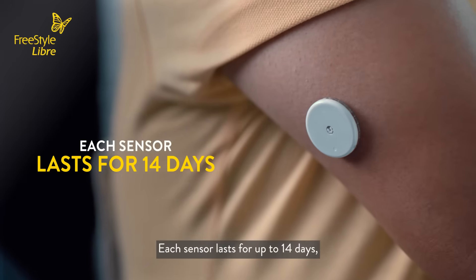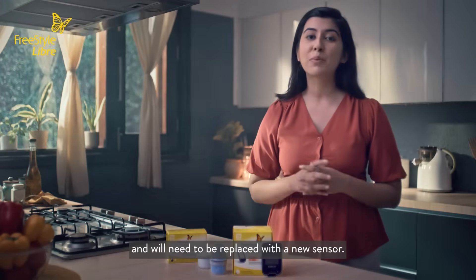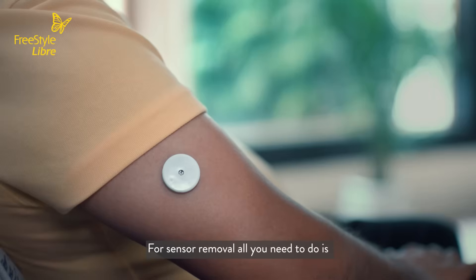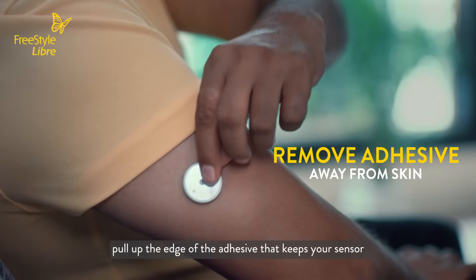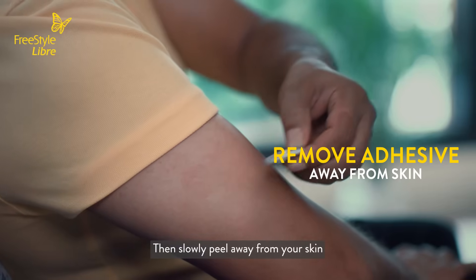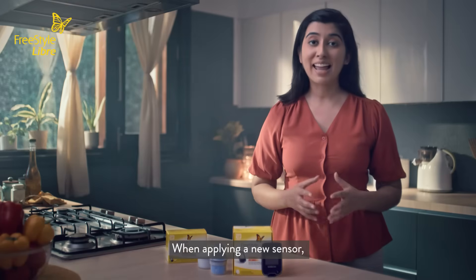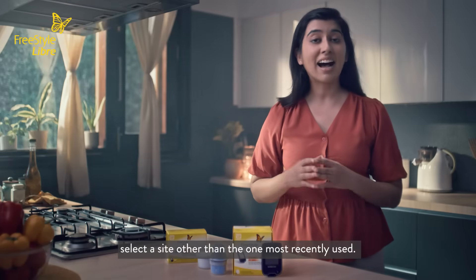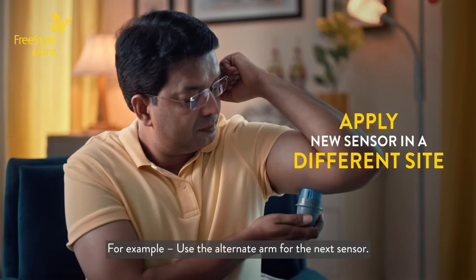Each sensor lasts for up to 14 days. After that, your sensor will stop working and will need to be replaced with a new sensor. For sensor removal, all you need to do is pull up the edge of the adhesive that keeps your sensor attached to your skin, then slowly peel away from your skin in one motion. When applying a new sensor, select a site other than the one most recently used. For example, use the alternate arm for the next sensor.